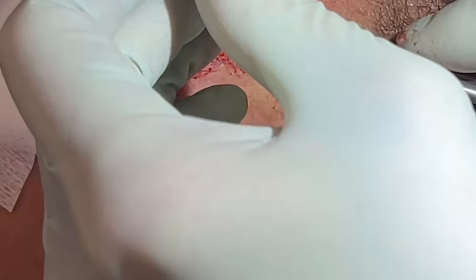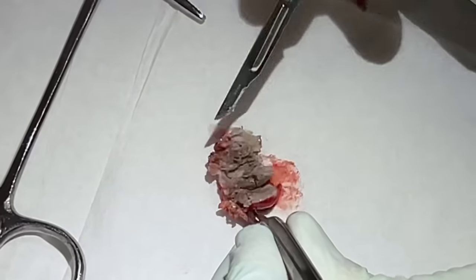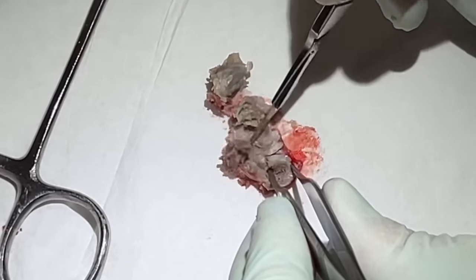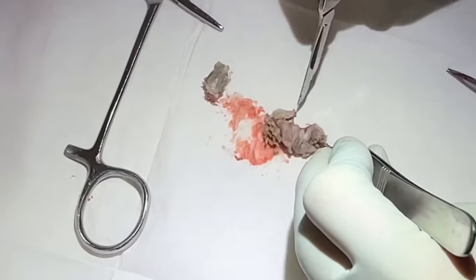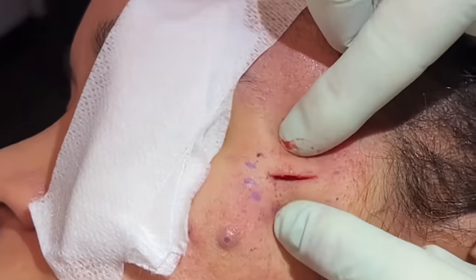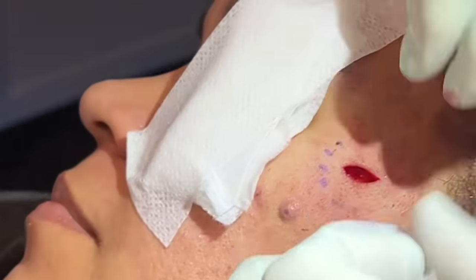A little pressure there — one last attachment, got it. You can see here, even with all that we got out, there's pretty good fill on that sac still — very dry contents, almost like paper mache. You can just peel it back layer by layer. That fibrous sac holds on pretty well. Now let's check out the pocket. You can see these facial cysts really carve out a nice little pocket for themselves. We put in a deep suture that's going to close that — she may even feel a little indent for the first couple weeks, but fat tissue redistributes and the skin tightens down and gets back to normal fairly quickly.